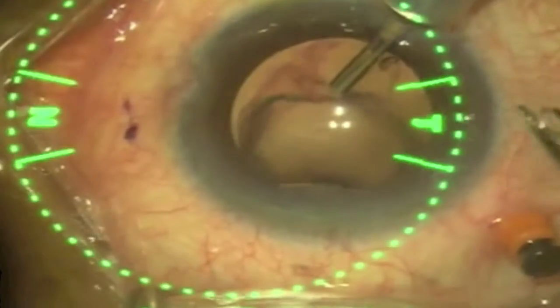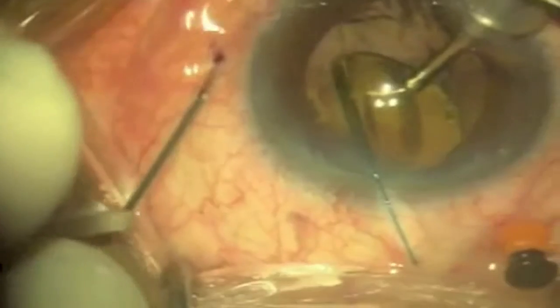The final pearl will focus on IOL fixation, and this will be instances where there is significant zonular compromise and insufficient capsular support. My go-to technique would be the double needle Yamane technique, which is a transconjunctival haptic fixation method.